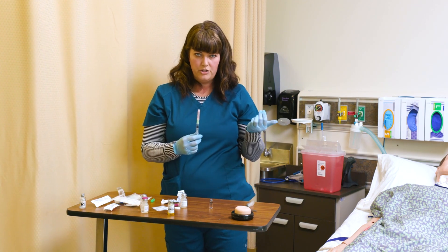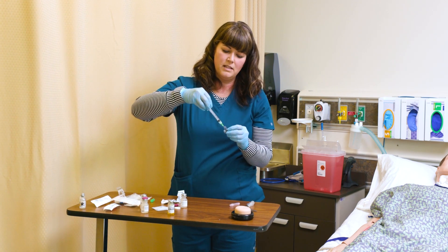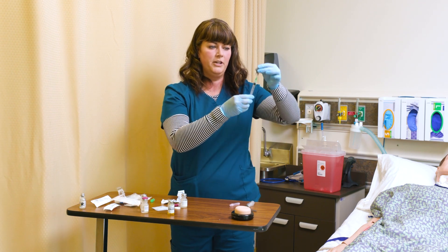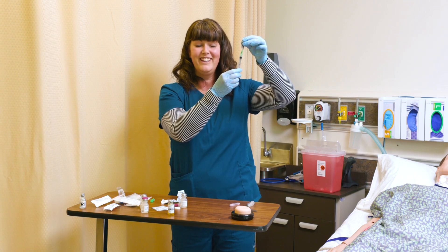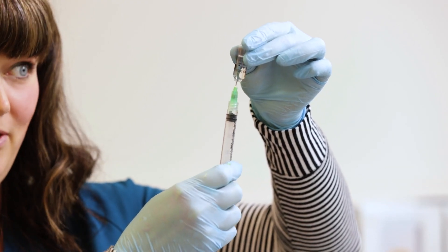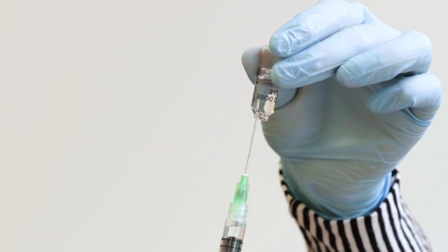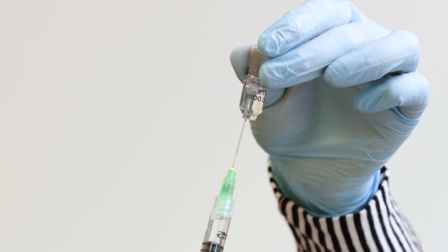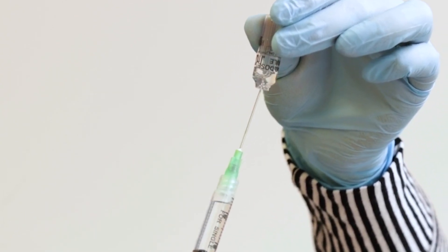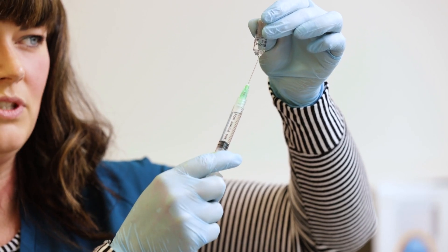I don't need to worry about air pressure here. Sometimes with ampoules — and this is really cool — you can actually kind of invert it and the solution will not fall out. You can actually draw up the medication and because of the surface tension on the fluid, it will not drip out, which is kind of cool.